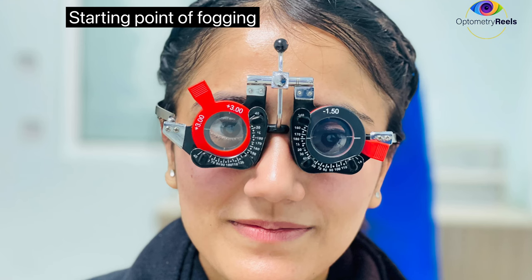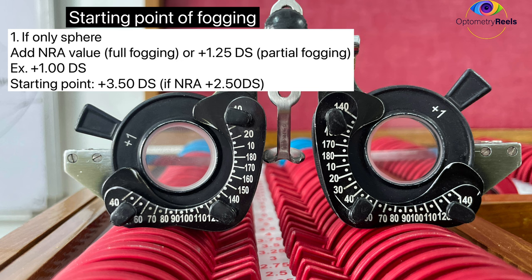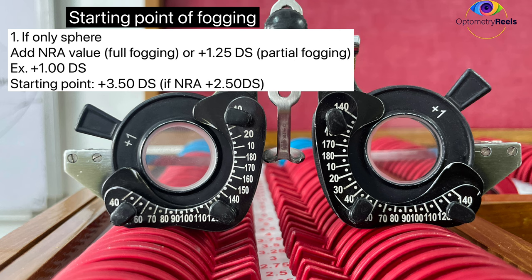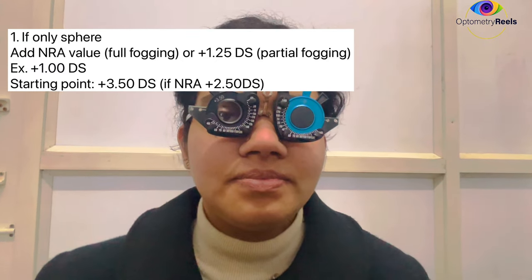Now let's understand the starting point of fogging with certain examples. There could be three conditions. The first condition is where we get only a spherical value on retinoscopy or autorefractometer. In that condition we add the NRA value for full fogging, or plus 1.25 for partial fogging. For example, if we get plus 1 on net retinoscopy, the starting point of fogging will be plus 3.5, considering NRA to be plus 2.5. We use plus 3.5 as the starting lens and from here we defog the eye.